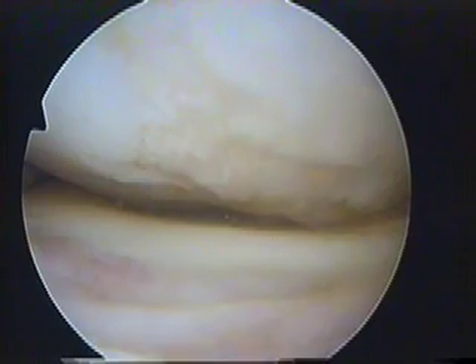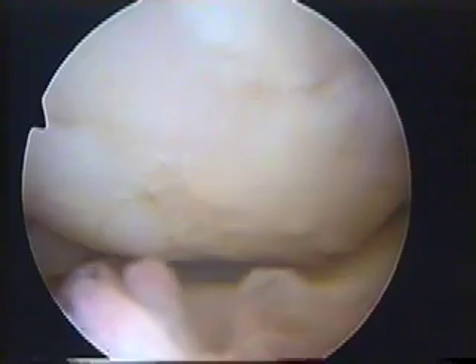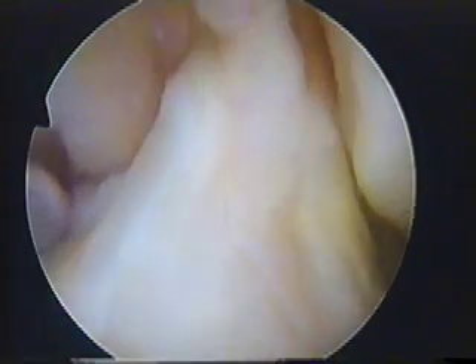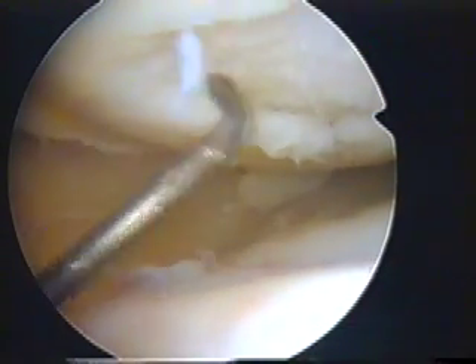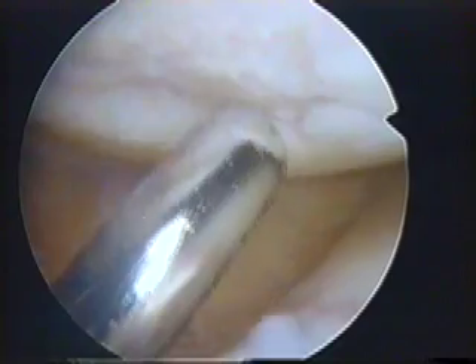Here we're looking into the inner bearing of the knee. There's the lower end of the femur directly in front of us. You can see that the surface is nowhere near smooth. In the centre of the joint there's the anterior cruciate ligament which looks quite normal. The bearing surface on the lower end of the femur is quite loose — as you can see it's coming off there virtually at full thickness.